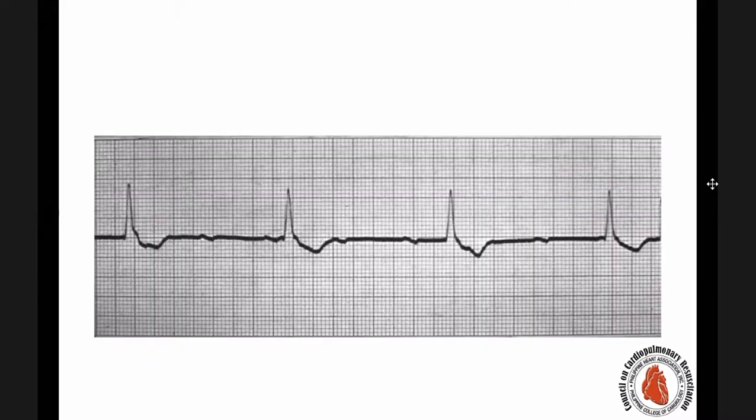So let's just try to dissect this one. So this is a P wave not followed by a QRS. If this is a drop beat, walang PR interval dito eh, pero dito merong PR interval. It does not follow the second degree AV block that we have talked about. Okay? This is another P wave. So kung titingnan mo, somehow there's a P wave here, a P wave here. Ito may P wave, dito may P wave, dito may P wave. So regularly occurring siya. And then the ventricular rate is also regularly occurring.